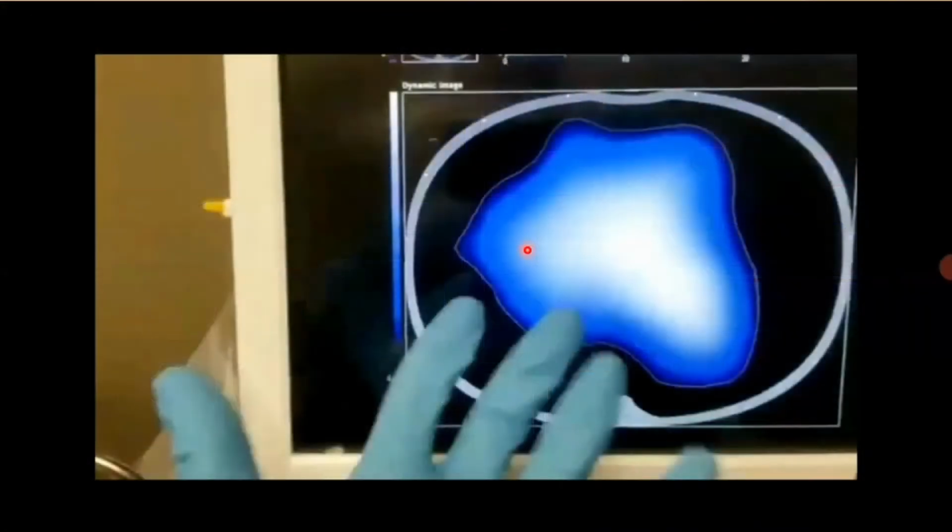I'm going to show you another video to get some more dynamic images in. This is going to be on ACPC with the optimal PEEP set at 8, and then I'll transition to APRV. You'll see the T high and the higher mean pressure that we get with APRV, and you can see the difference in the distribution of ventilation. With ACPC, on inspiration, you'll see the blue up here, and on expiration, it becomes extremely small. And then you don't really see that with APRV.